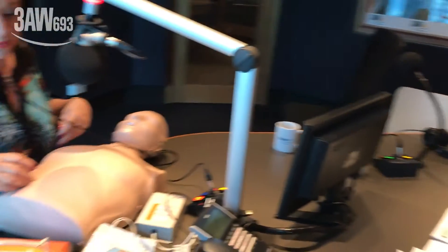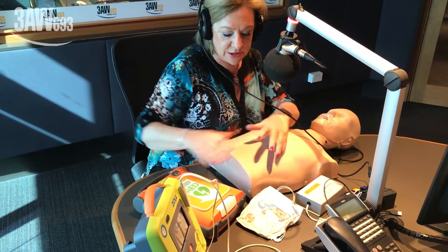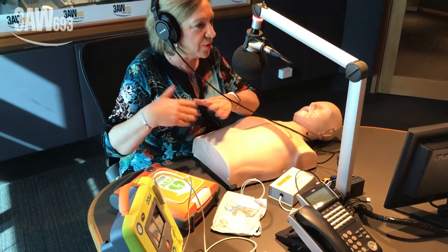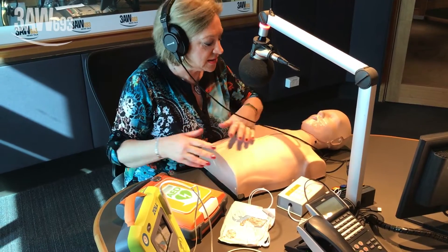Nurse Anne has brought in a whole lot of gear. She turns on a defibrillator and warns listeners that since this is not going on to a real person, she will need to change over to a simulator. This is a demonstration mode only.